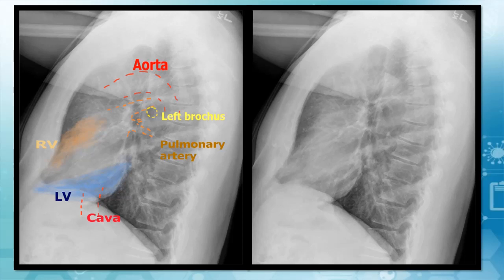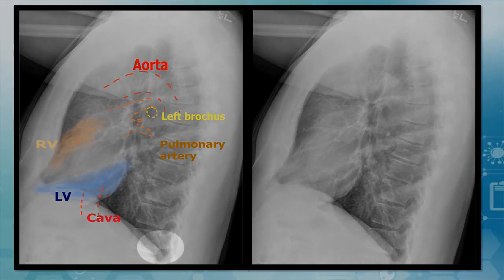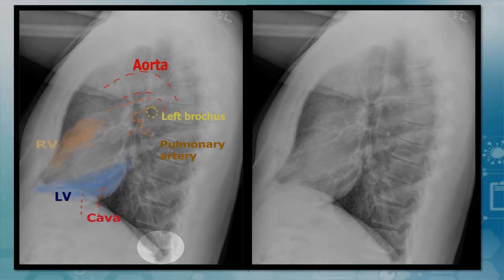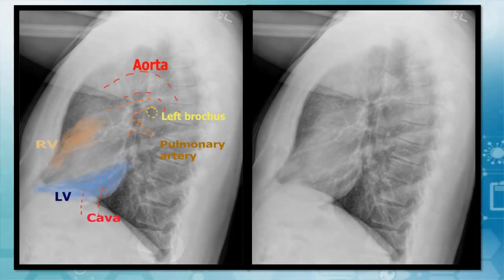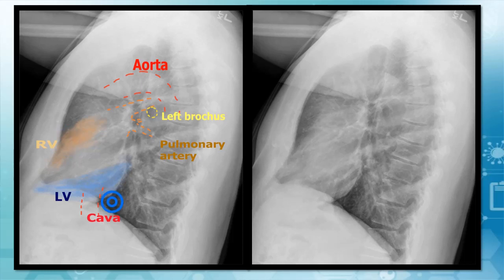On a lateral x-ray, there aren't many structures to notice, and most likely the major benefit is the clear view of the costophrenic angles right in the back, which makes them ideal for diagnosis of small pleural effusions. The heart should touch the inferior one-third of the sternum, and always leave a translucent triangle in the back.